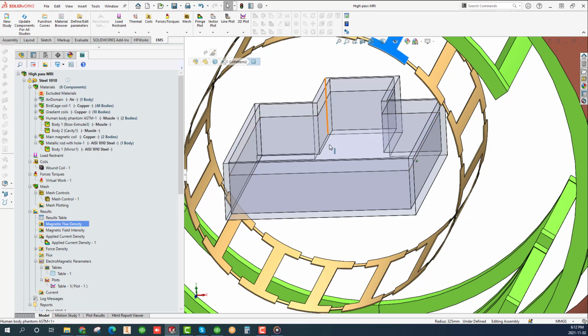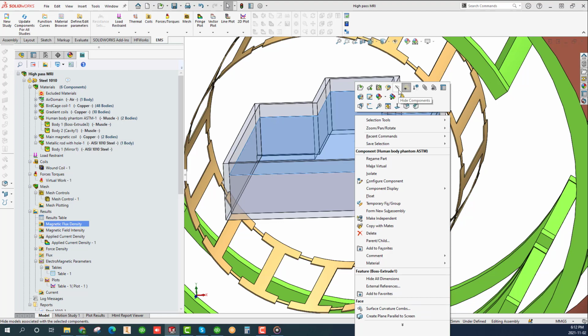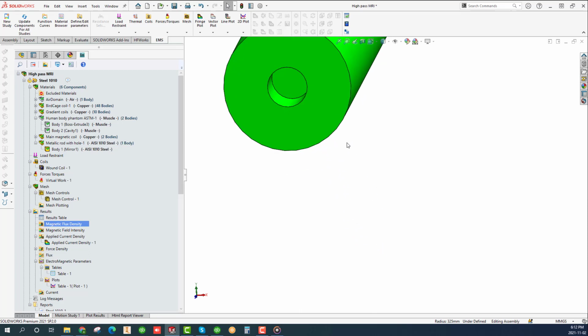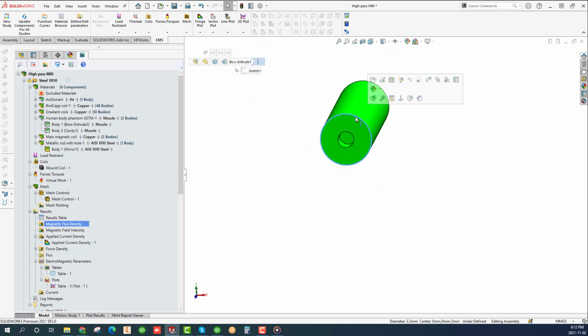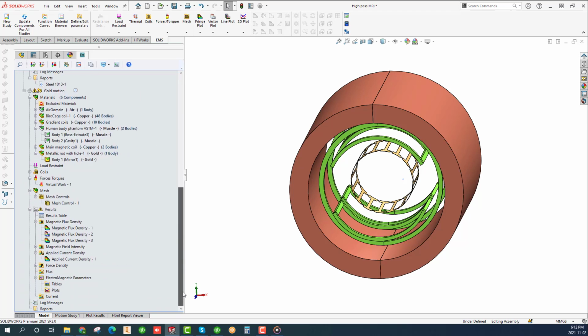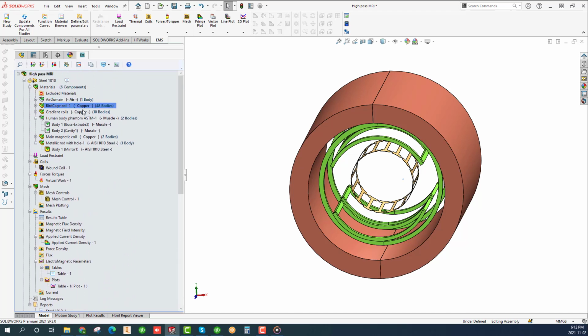The human body phantom is made of muscle material that has the electrical and mechanical properties of actual human tissue. Inside the phantom, we placed a small metallic rod of about 0.62 grams, close enough to the weight of a ring or other jewelry. We have two EMS studies. In the first one, the rod is made of a common ferromagnetic material, steel 1010, whereas in the second study, the rod is made of gold. We shall compare the force acting on the rod in both cases.